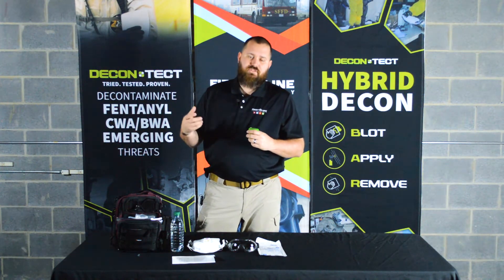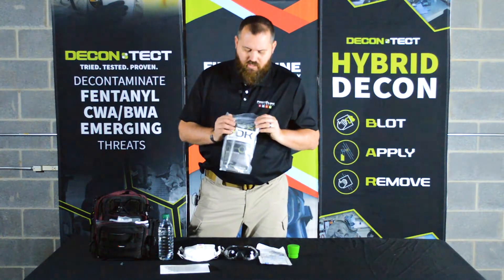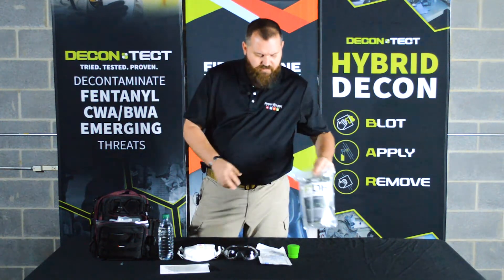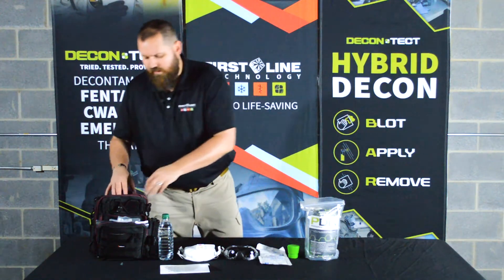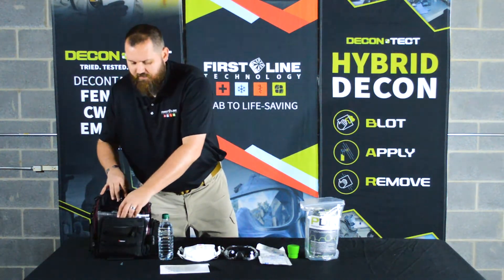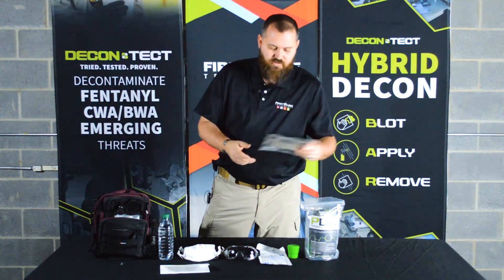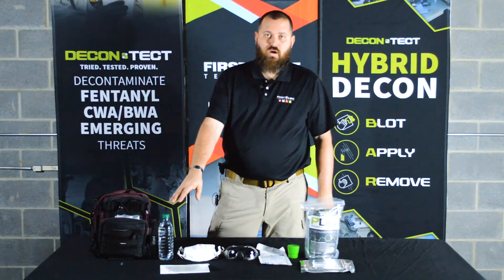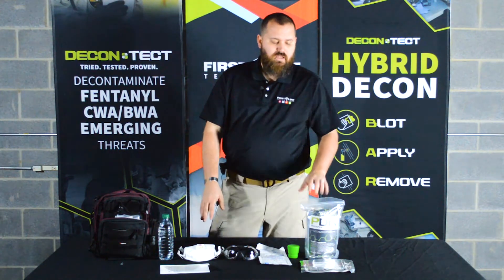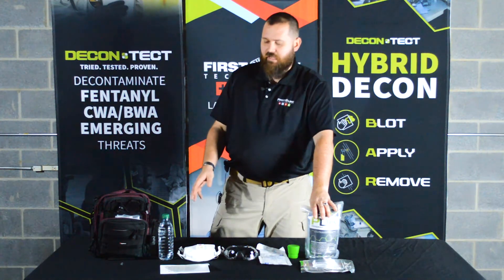Also, by wetting it, it reduces the risk of aerosolization. Next, we've also got a full PDK. The PDK includes Dahlgren Decon, all three parts, and two FiberTech wipes. We'll give you an additional FiberTech wipe. The intention is that you can use the first FiberTech and your water to douse your victim, and then the additional one is for decontaminating the responder or the area after the fact.